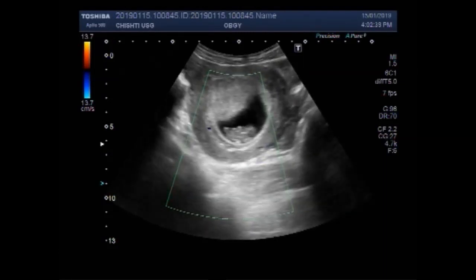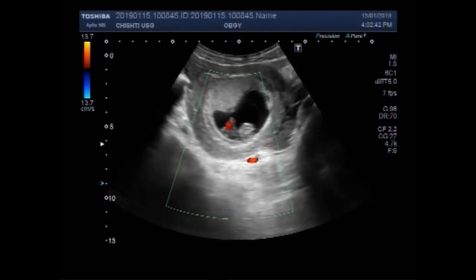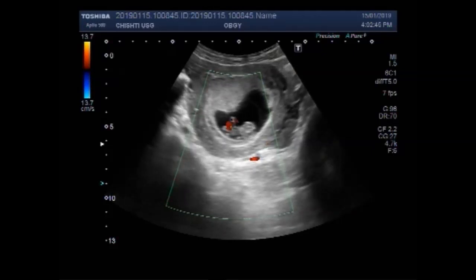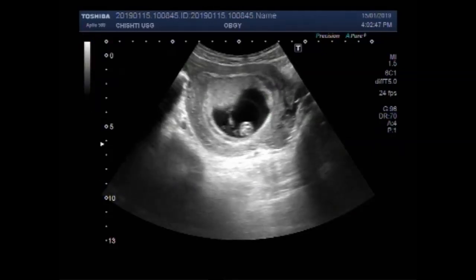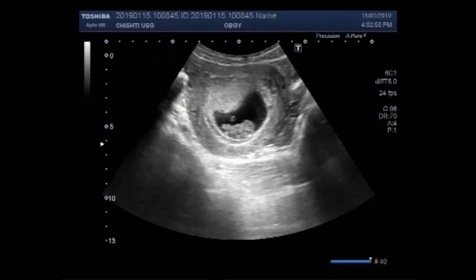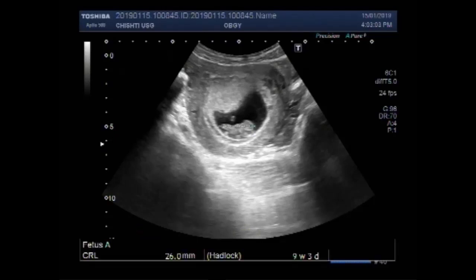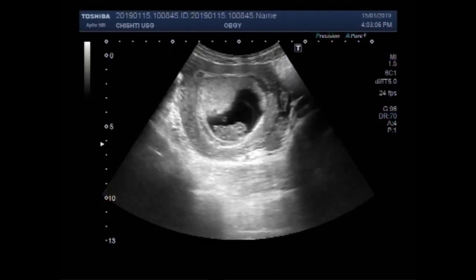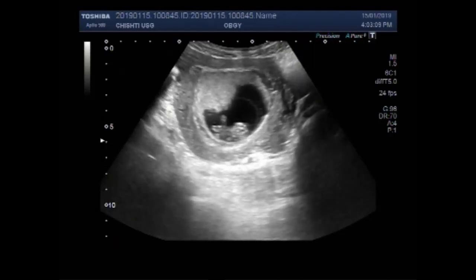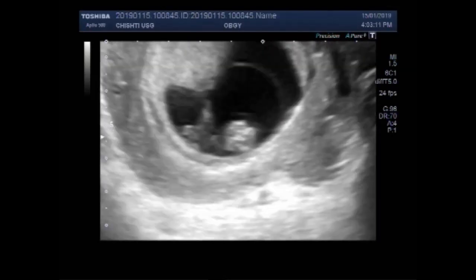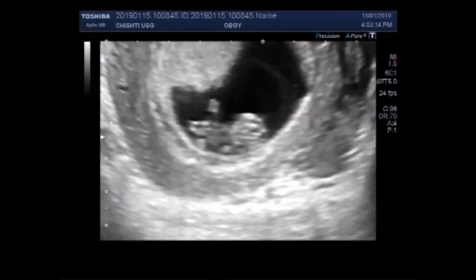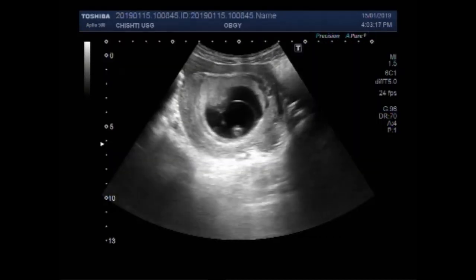So in spite of this large ovarian cyst, the fetus is intact. Now you can see the fetal cardiac activity — a tiny heart is beating.